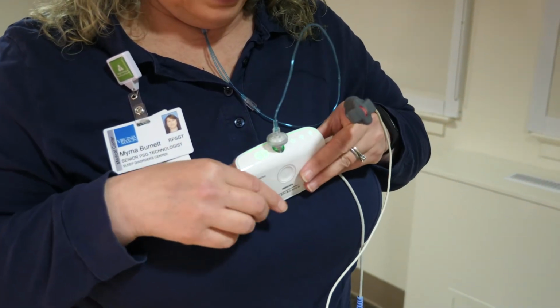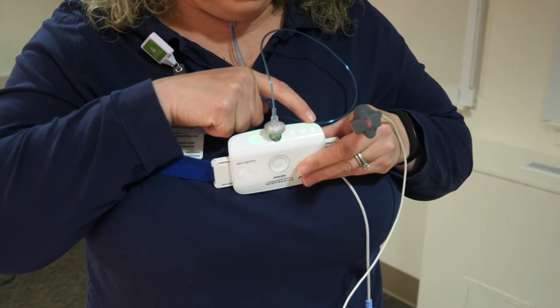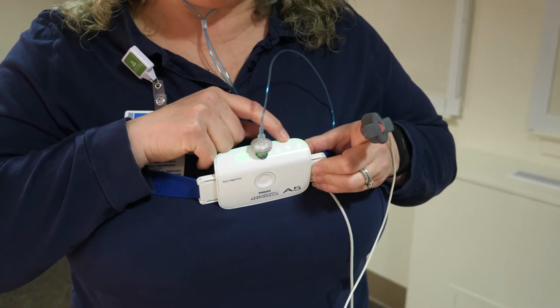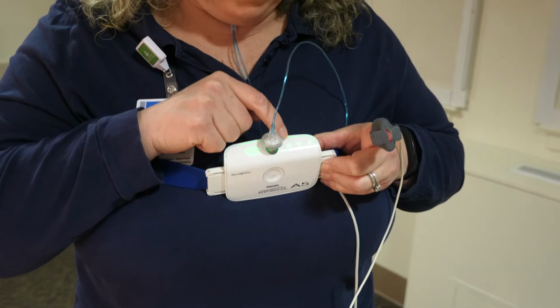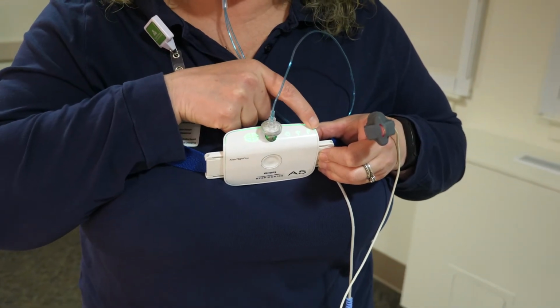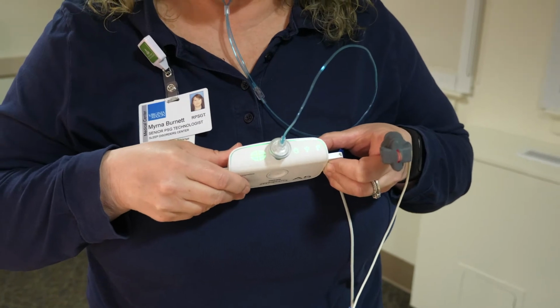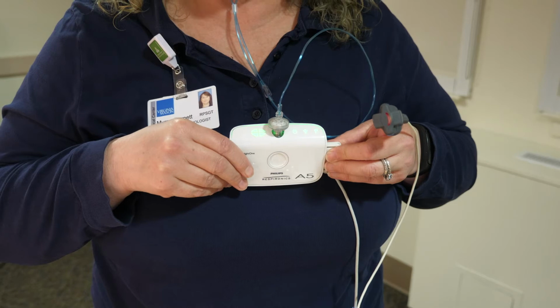There are sensor lights for each of the 3 sensors. On the device, there's a finger for the pulse oximeter, there's a person that's the belt, and there's a face for the cannula that's in your nose. Once the unit recognizes it's got a signal from all 3 of those sensors, on the other side is a pi light. This is when the unit is calibrating and initializing and actually getting ready to start recording.